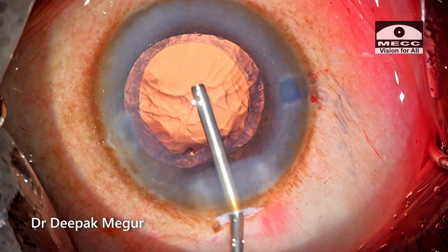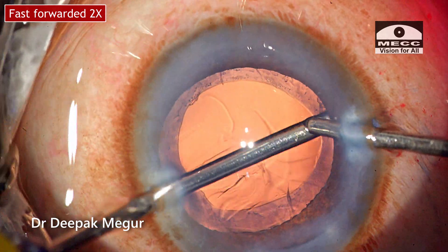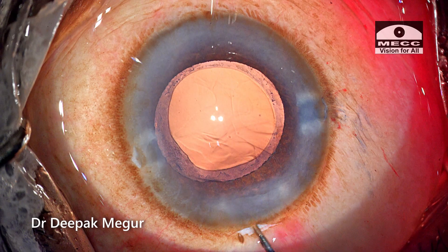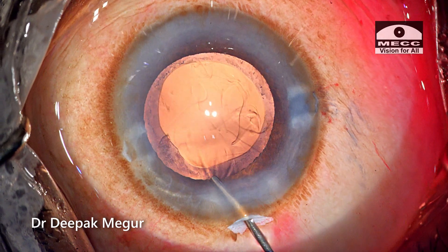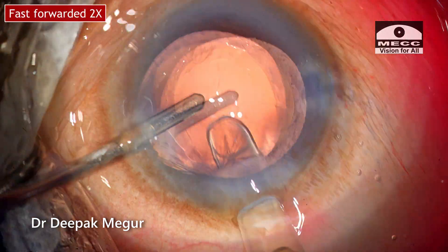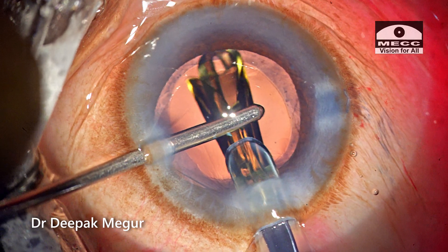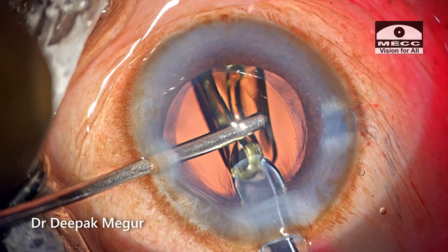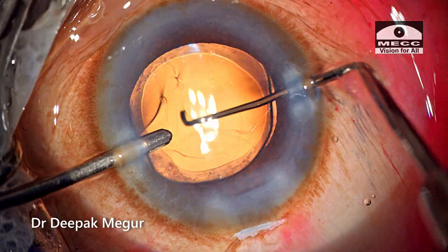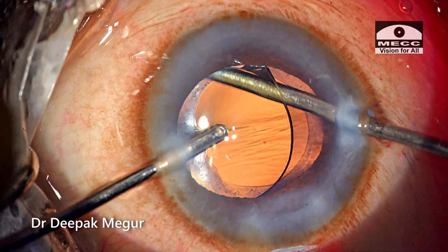Nucleus management is done and now it's time to deal with the cortex, which is aspirated out quite easily. Then it's time to place the intraocular lens. I'm using the hydroimplantation technique — irrigation is introduced to the side port and the BSS itself maintains the capsular bag and anterior chamber. I'm using a single-piece hydrophobic lens, which is gently maneuvered into the bag. Any viscoelastic sticking onto the lens is irrigated out. The case is done.